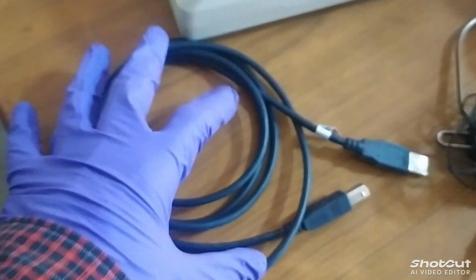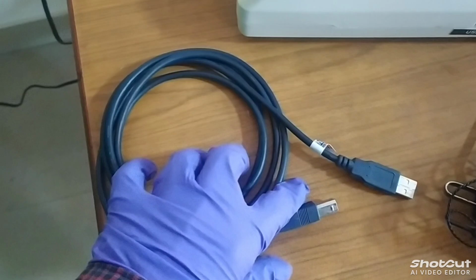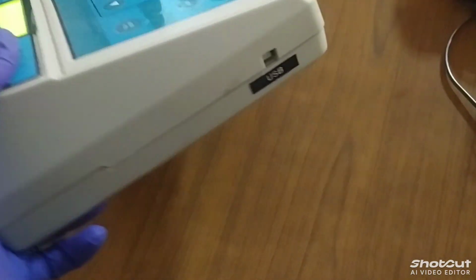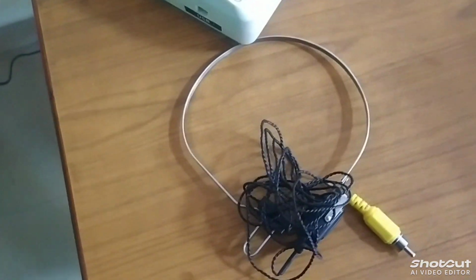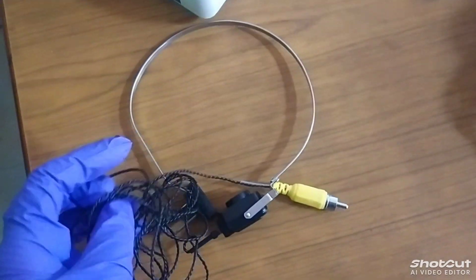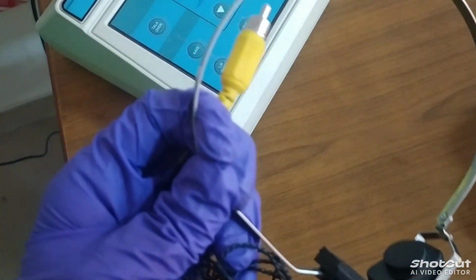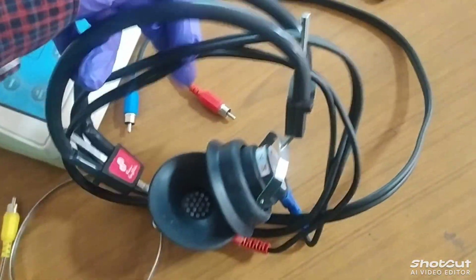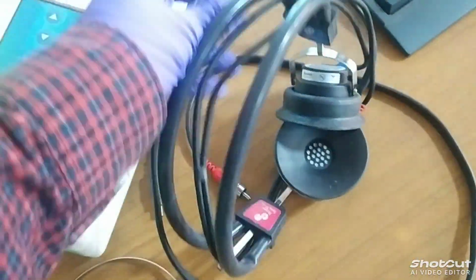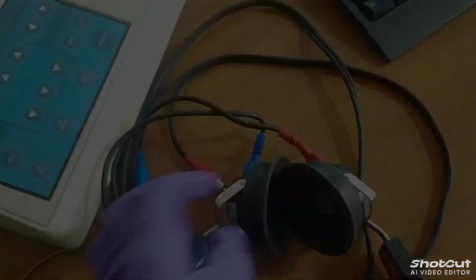So this is the USB lead which is used for connecting our device with the PC. Here is your USB port, and this is your bone conduction test handset, like this, and this is your headphone device which is used for taking the air conduction test.